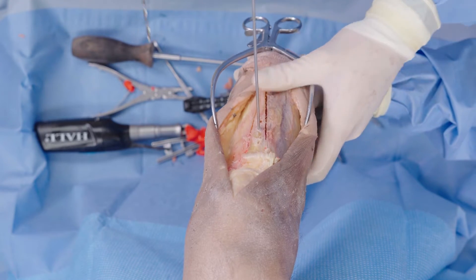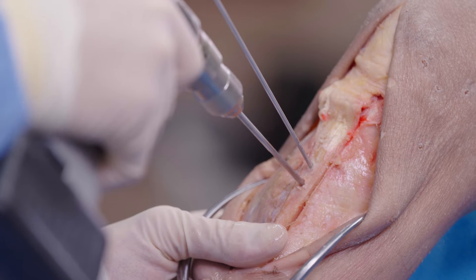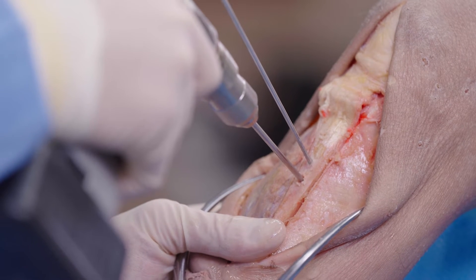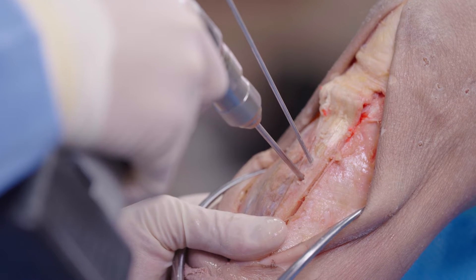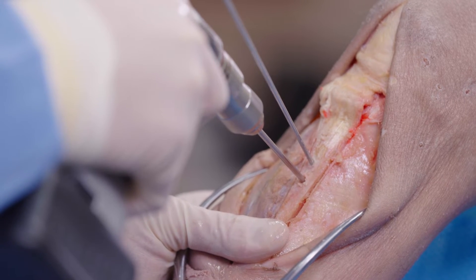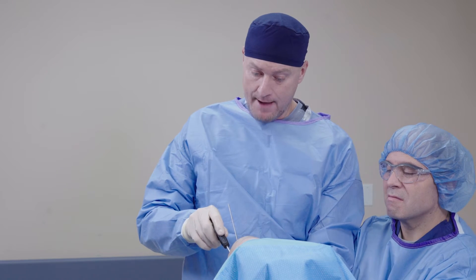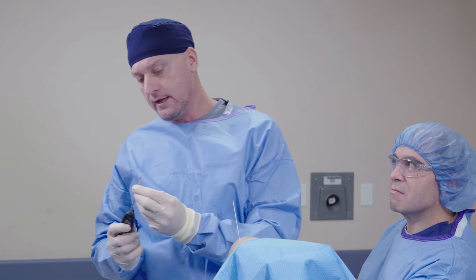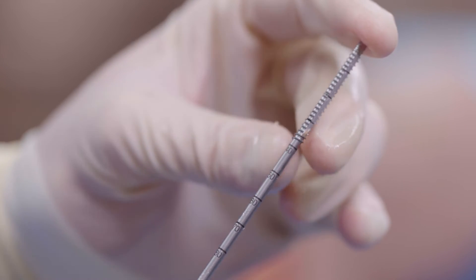You can use the guide — there's actually a guide available — but I'm going to freehand this right now. I'm now feeling that far cortex. I'm going to tap. The great thing about this tap is that we have graduated lines, so I can get my depth directly off of this.